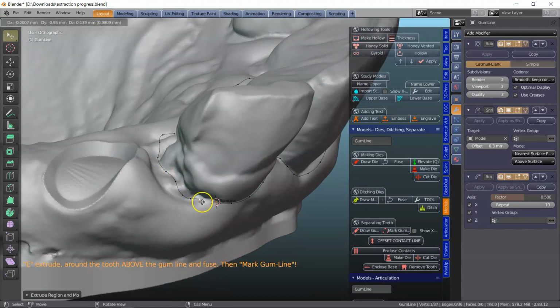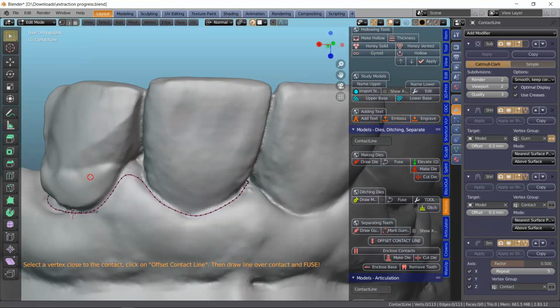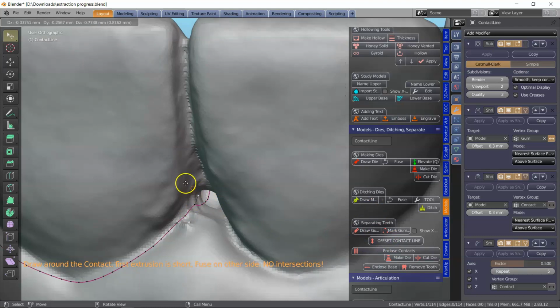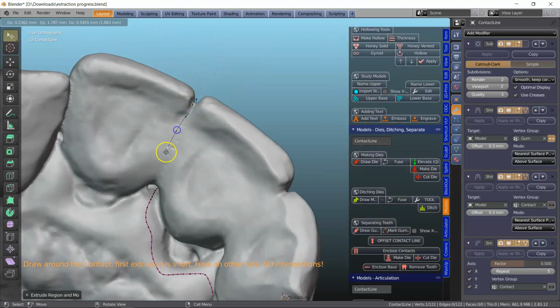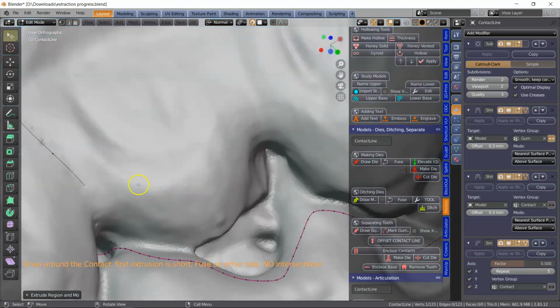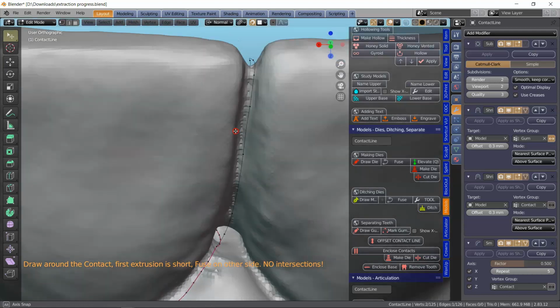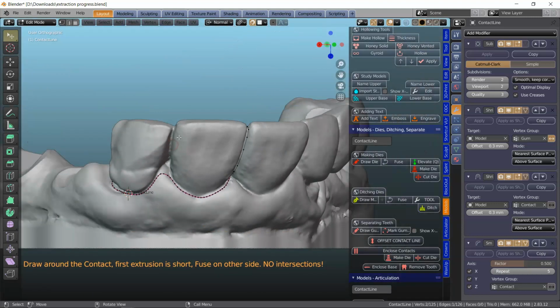I'm going to section one side. Alright, okay, so mark, and we're going to bring this across the top here. Okay, there, and we're going to extrude this upwards, and then I'll do the other side. You've got to be very vigilant that this is done correctly. This is maybe a little bit of practice, I don't know. Just inspect and see that your lines are above the surface, which they should be. Let's give this a go.